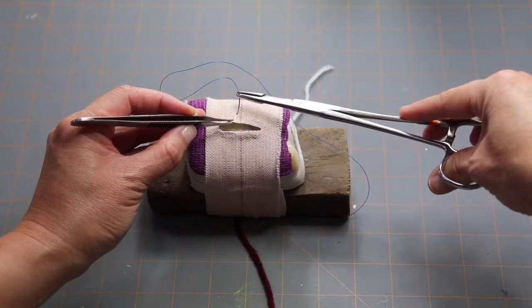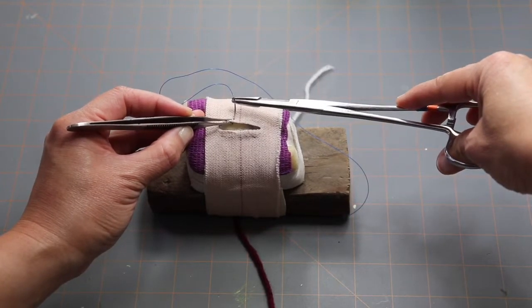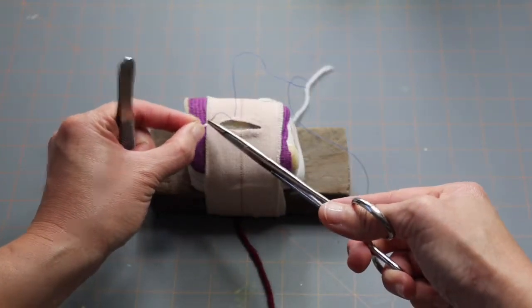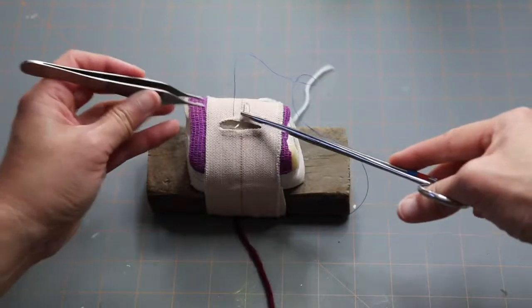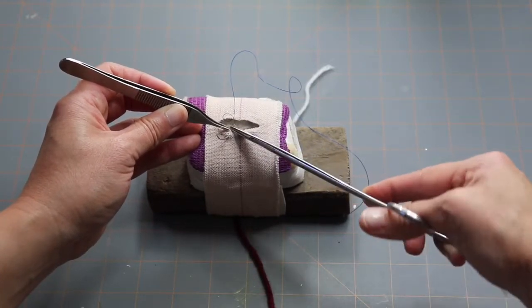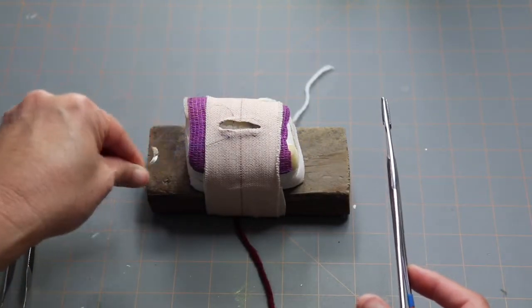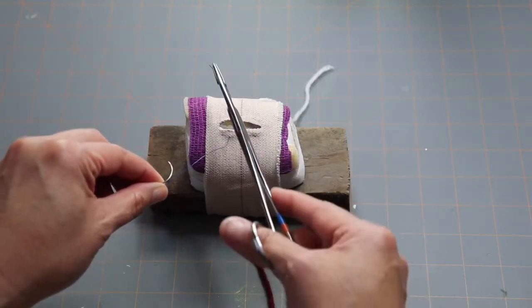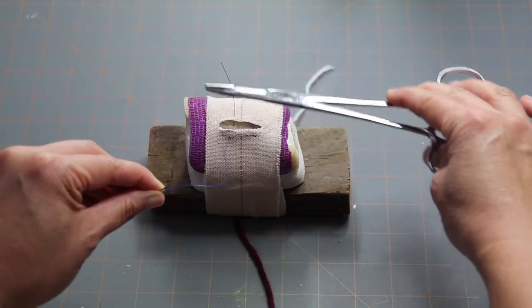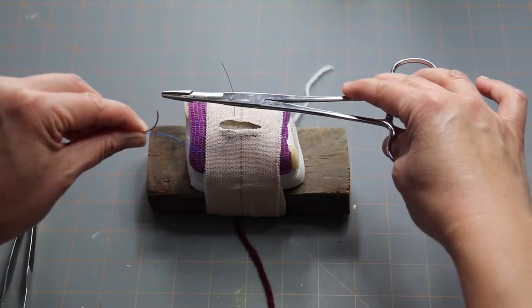Add a 90-degree angle to the incision and drive your needle through — place it about three millimeters from the edge of the incision. Pick it up, reposition your needle on the needle holders, and ratchet it once if needed. Pick up the end closest to you of the incision and drive through again, about three millimeters from the edge. Push it through, grab it towards the middle, and pull the needle all the way through. Put down your forceps, grab your needle and suture, and pull it most of the way through — make sure you still have a tail to create your knot with. Now keep your needle holder in the middle, in between the two sides of the suture.